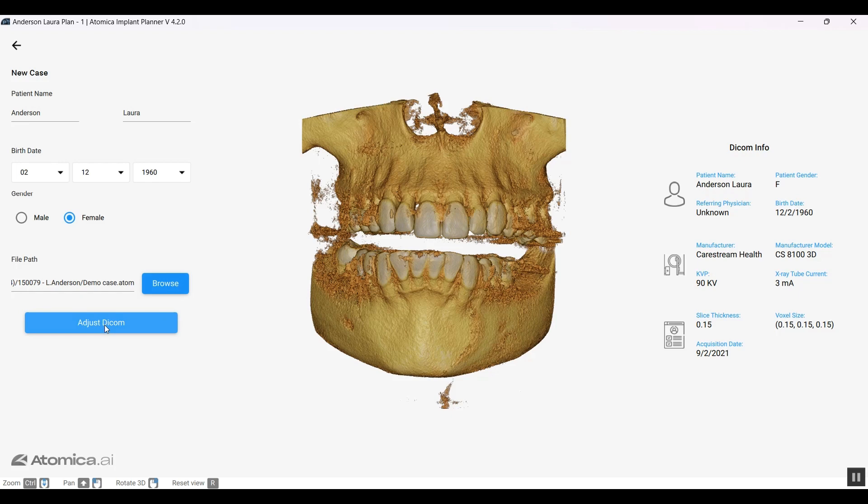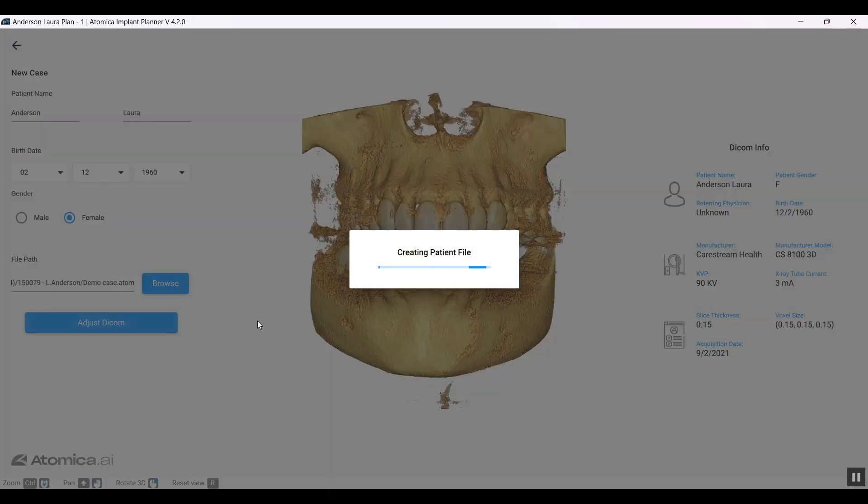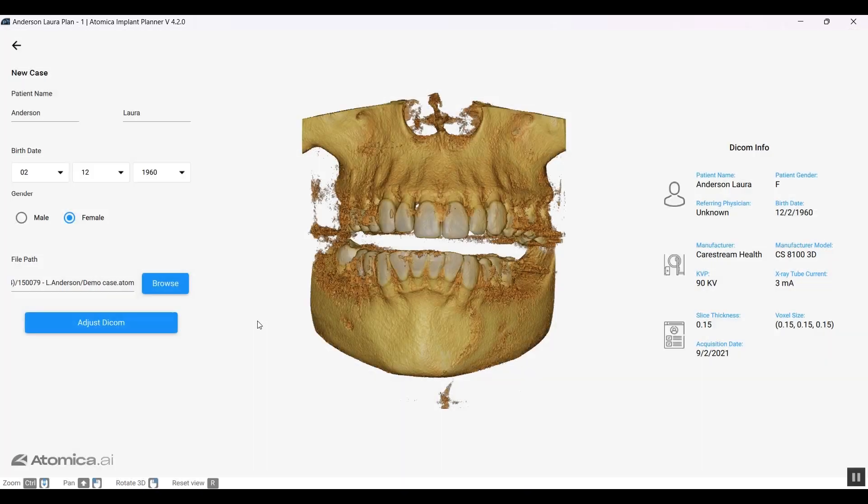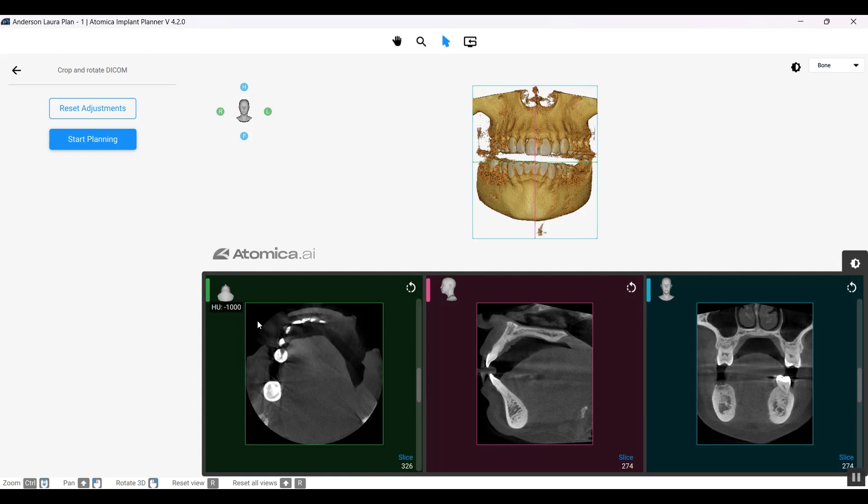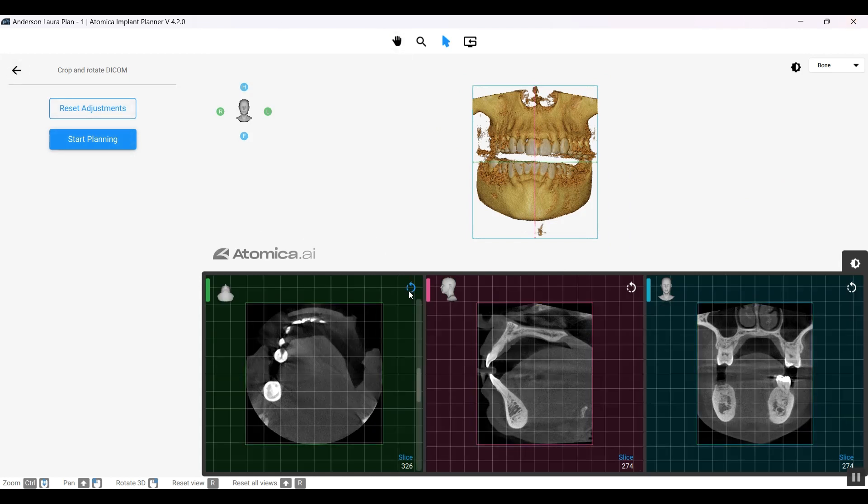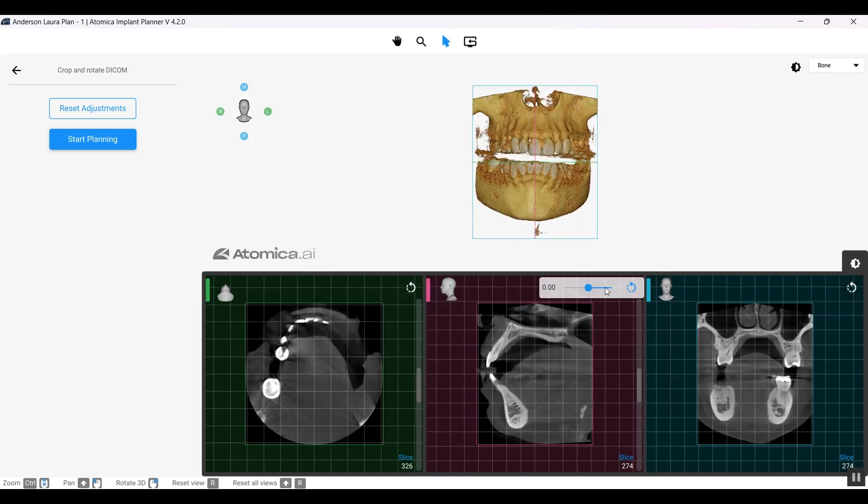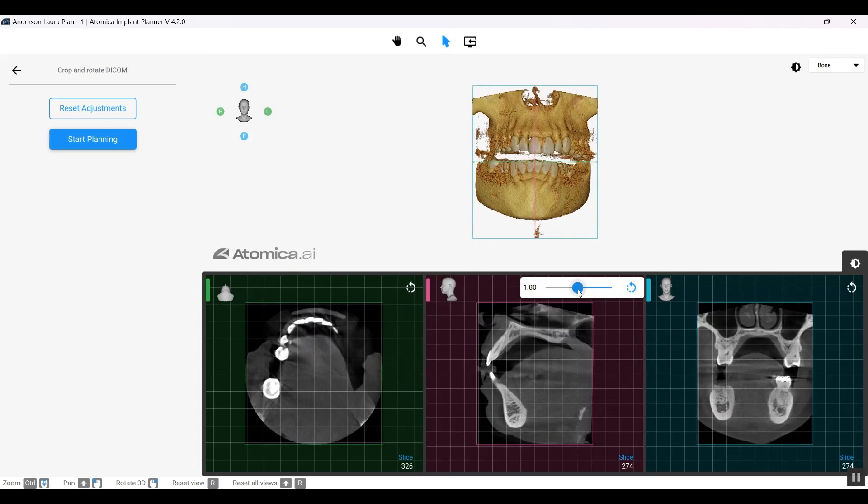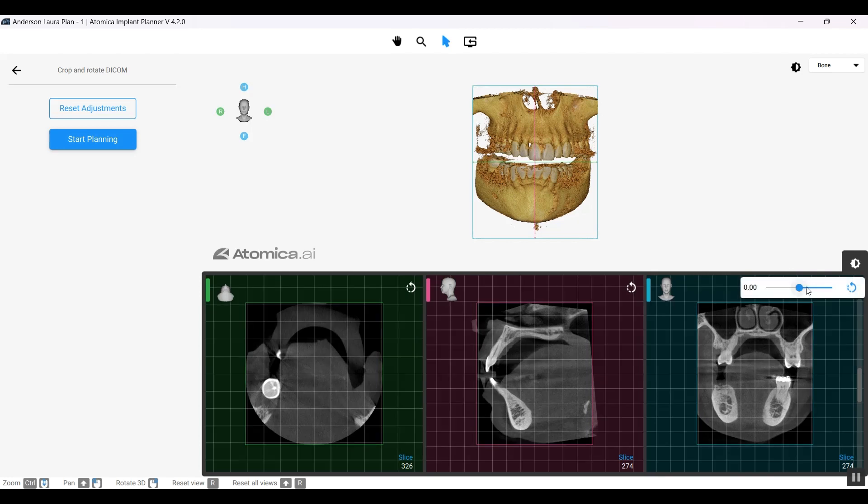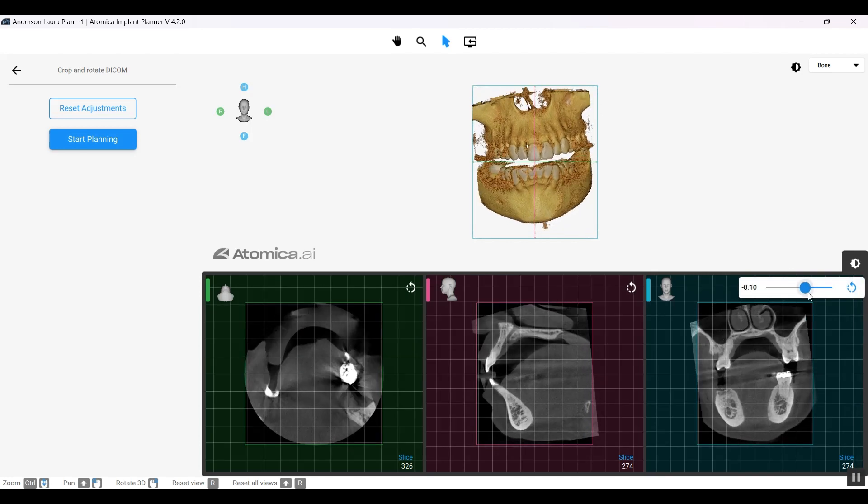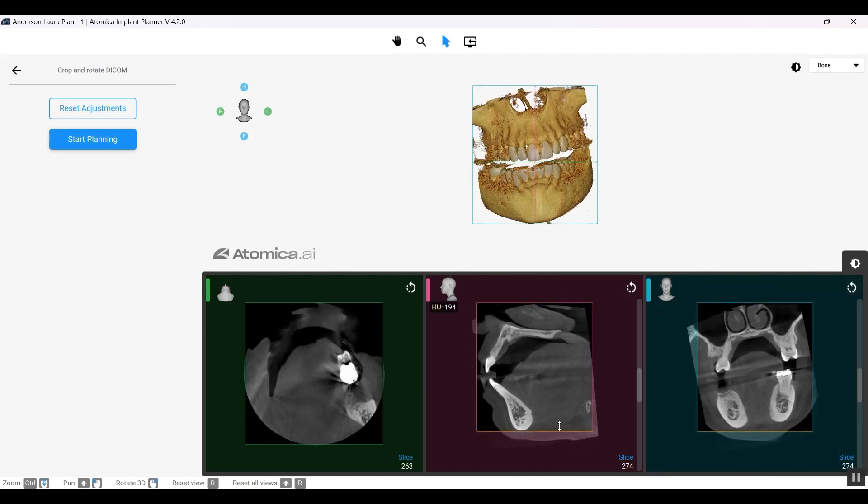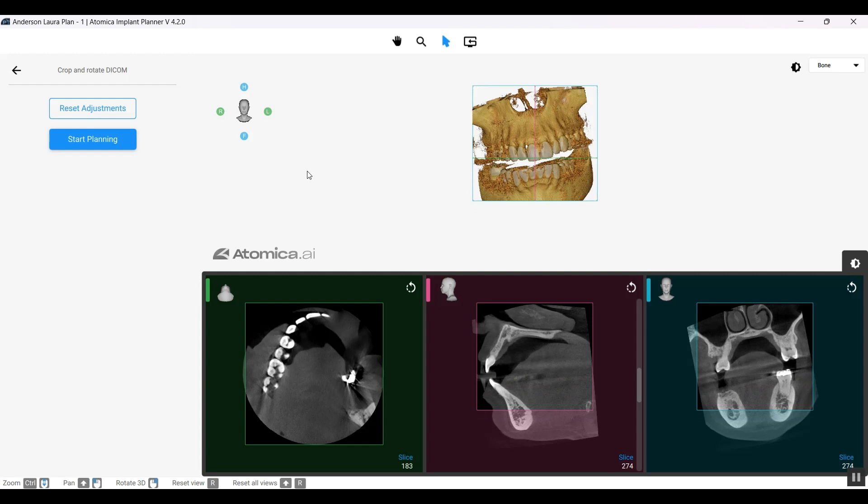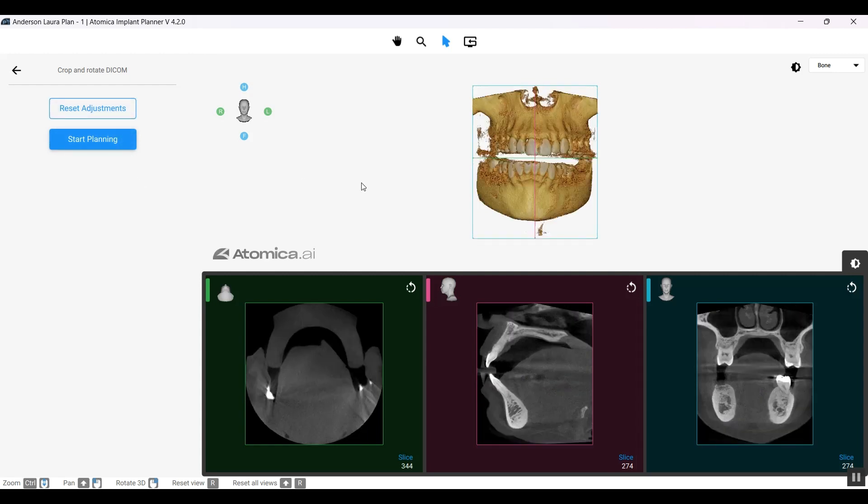You need to select adjust DICOM. When you select that, we'll move forward to adjusting our scan. If the patient moved while taking the scan and the scan is tilted or misoriented, we can adjust and utilize these different cross sections to adjust the orientation in place. We can also crop out any unwanted scans, but I prefer to reset all the adjustments as it's perfectly in place.